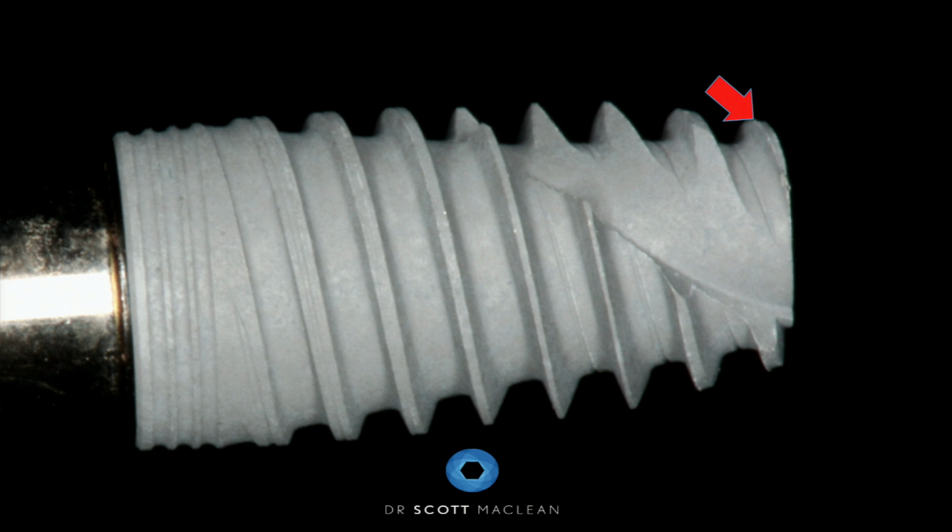If we look at the thread pattern itself, it starts with a very knife edge thread at the tip of the implant, going into a knife edge with a square area, and then at the top, going into a square. So as this implant goes in, it acts like an osteotome, making a lot of grab. If we're going to do this implant immediate or through a traditional stage, then it's very important to have these guided threads.